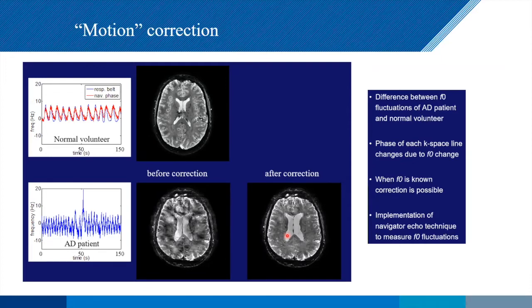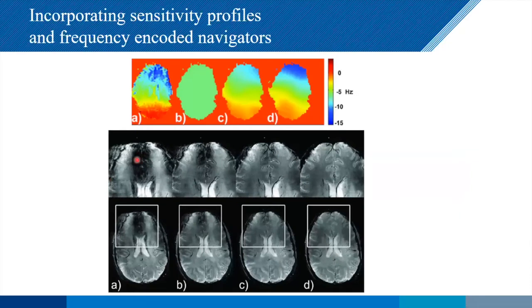Of course, this is assuming that this F0 change over here is uniform, is everywhere. But of course, we have much more information than that, right? Because we have all of our receive array coils. And we can look at the phase in each of those coils. We can see those changes. So we don't have to just make a uniform change. We can actually make a much more localized change to each k-space line. And if we do that, we can move over here.